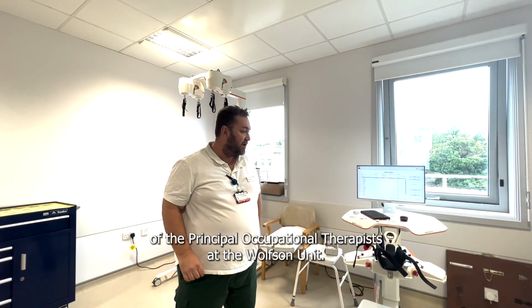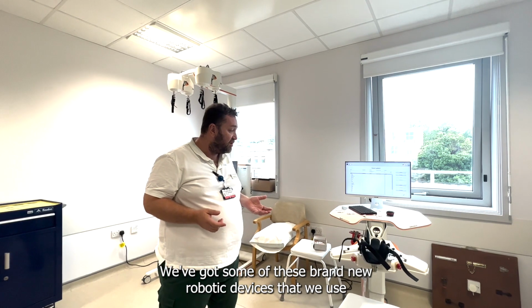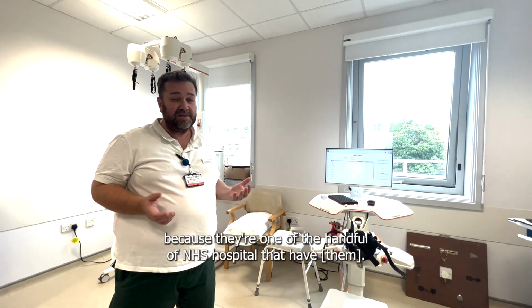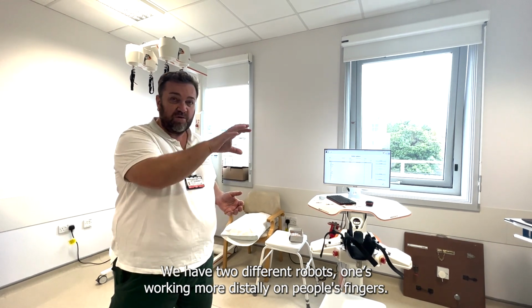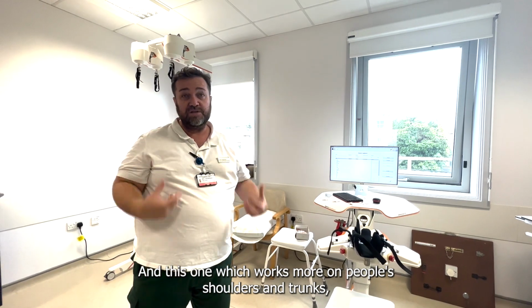So my name's Will, I'm one of the Principal Occupational Therapists at the Wolfson Unit. We've got some of these brand new robotic devices that we use in upper limb rehabilitation, which we're really lucky to have because they're only one of a handful of NHS hospitals that have. We have two different robots. One's working more distally on people's fingers, and this one which works more on people's shoulders and trunks.